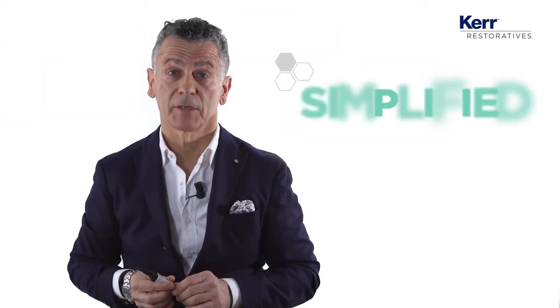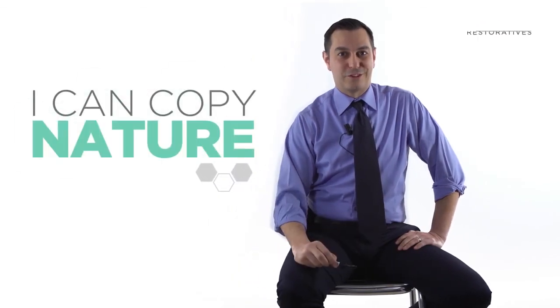Harmonize, for me, in one word, it's a must-have. Great restoration in a simplified way. Artistry and dentistry is to copy nature. And thanks to Harmonize, I can copy nature.